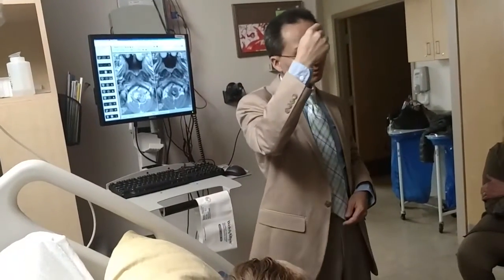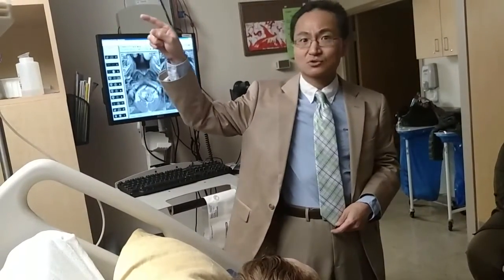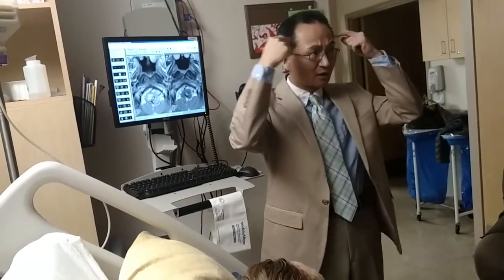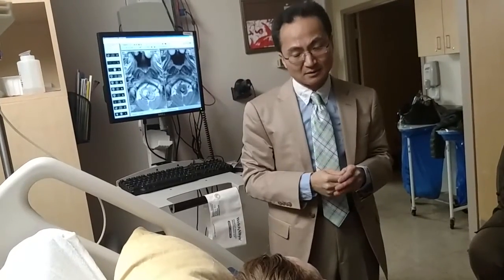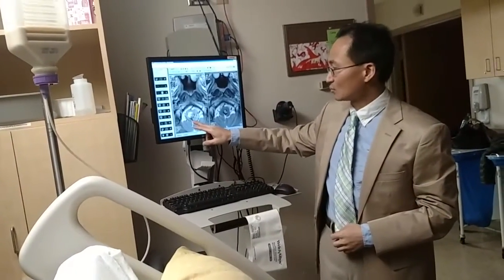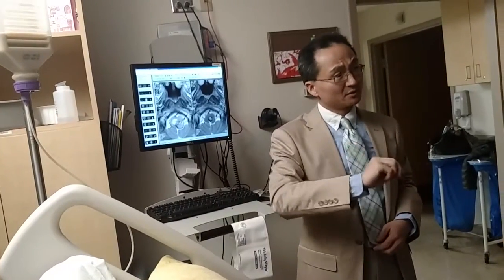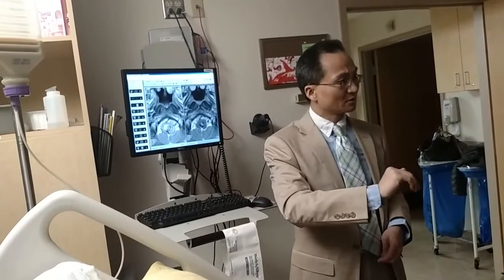So when we put a probe on this marker, we say, hey, that should be that marker on the 3D model, and then we correlate all that, and then it builds a 3D model of your brain with the highest accuracy that technology would allow. Nice. And then when we go in, I suspect I'm going to see a purplish surface. Tell me that's blood underneath. But if I don't see that, I cannot start dissecting the brainstem just anywhere.